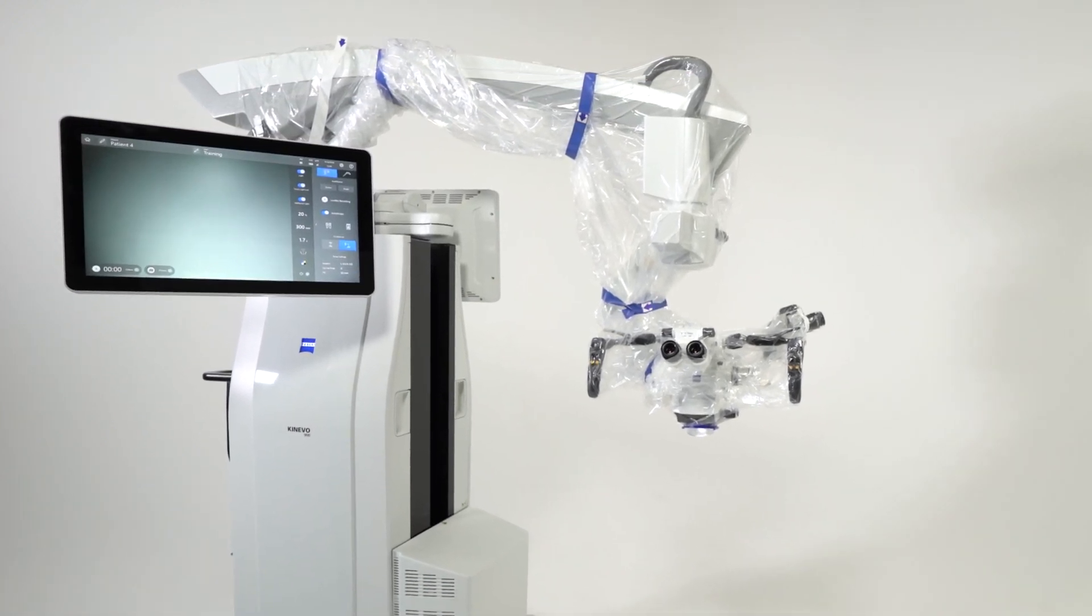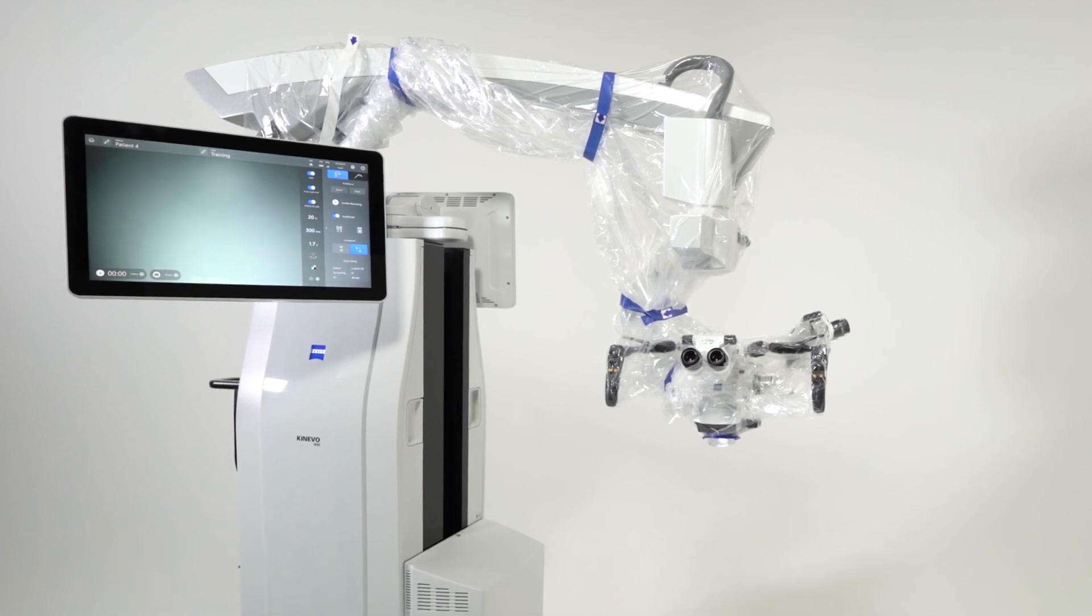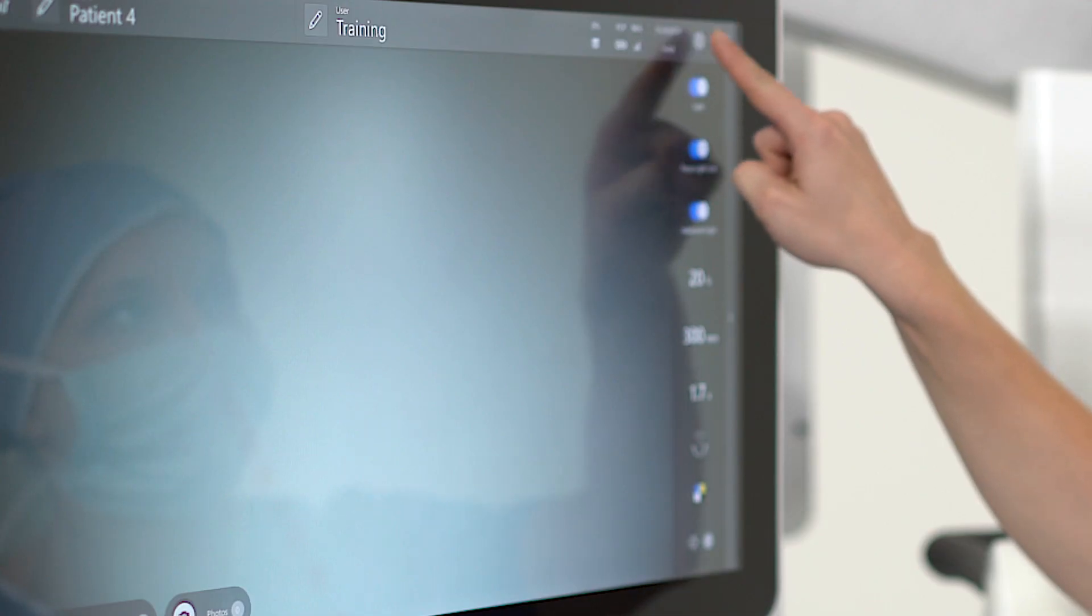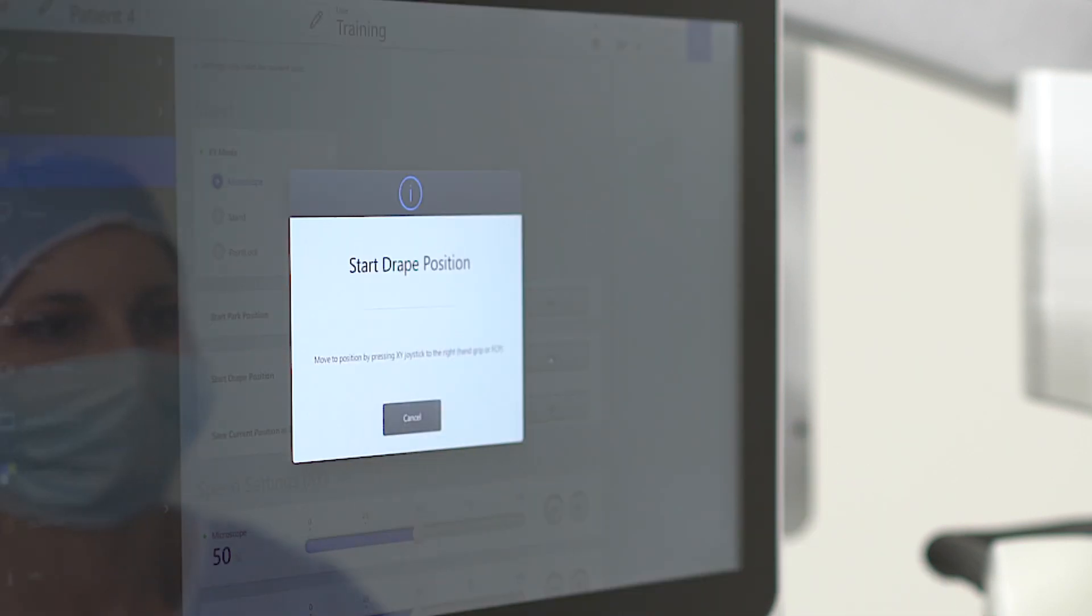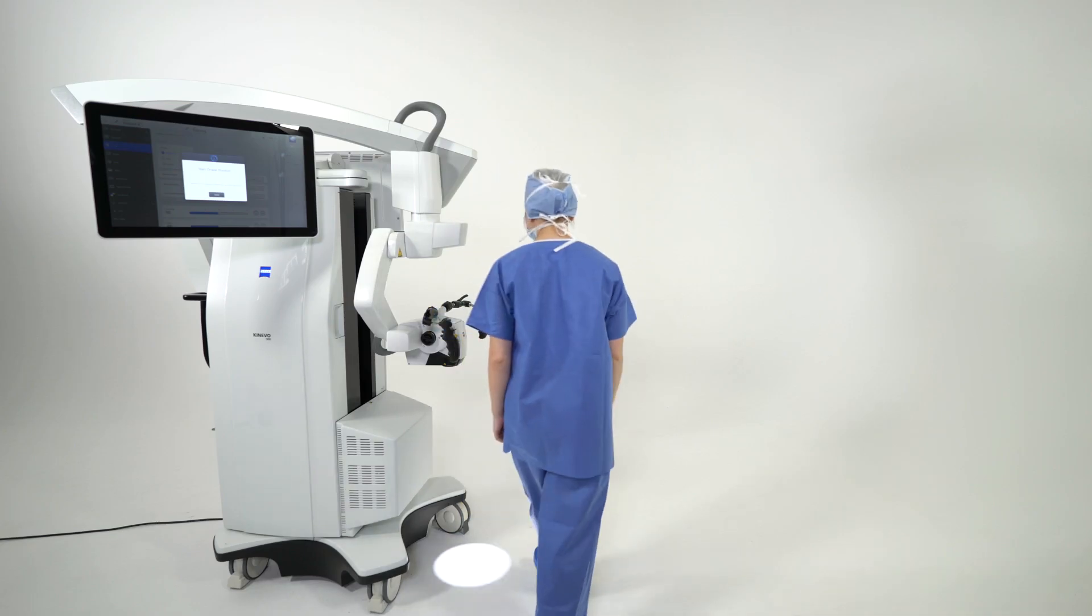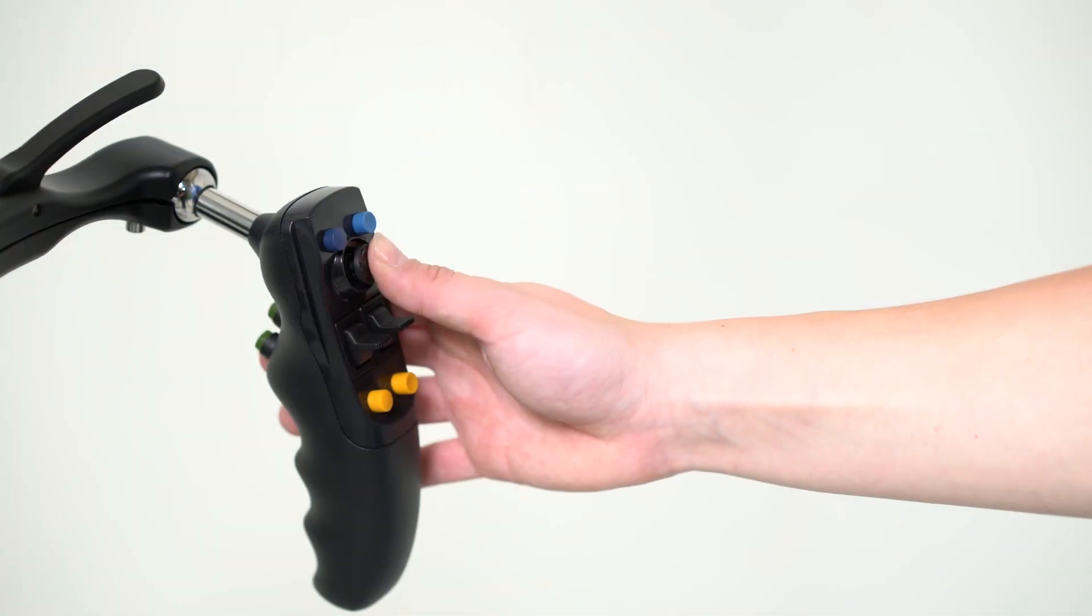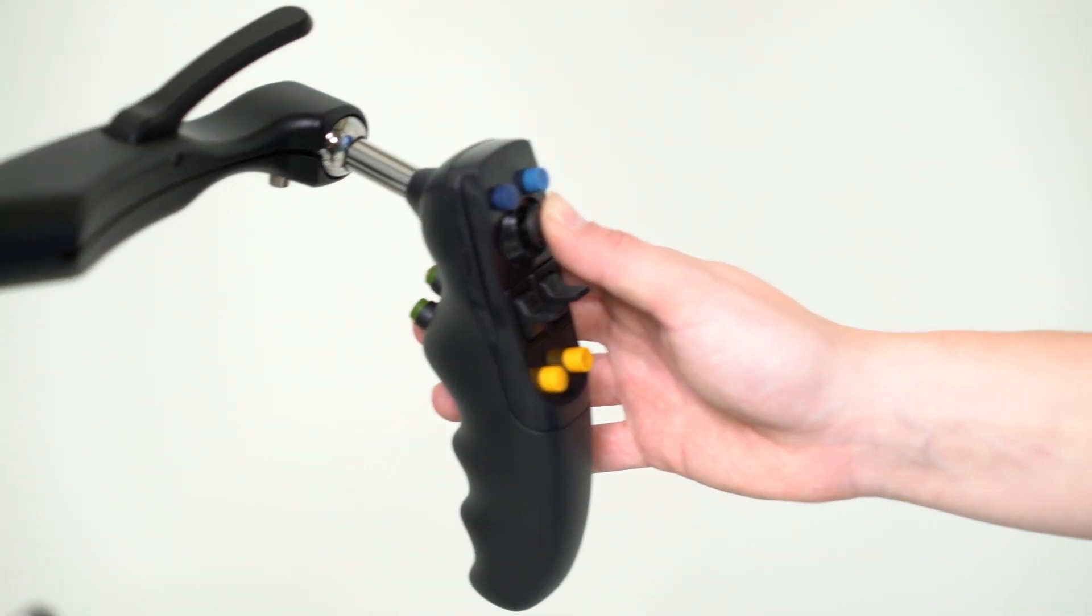To position Zeiss Kenevo 900 in its pre-configured drape position, go to Settings, go to Stand, press Start Drape Position. To move the Zeiss Kenevo 900 in its drape position, press the joystick of the right hand grip to the right.